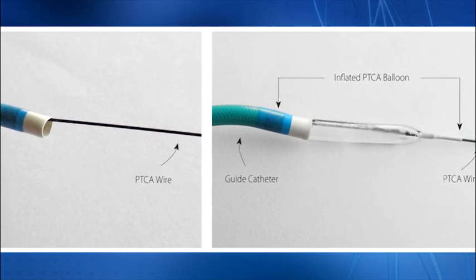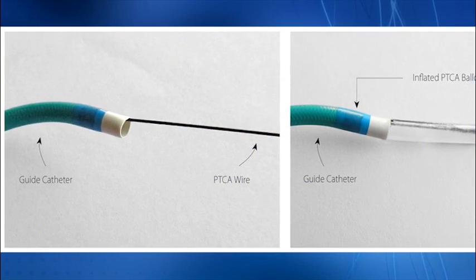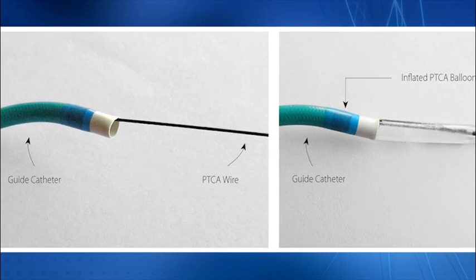We describe it as balloon assisted tracking of a catheter. You need to define the anatomy, cross the segment with a 0.014 inch floppy tip PTCA guide wire. If you are using a 5F diagnostic catheter, use a 1.5 millimeter PTCA catheter, and if you are using a 6F guide catheter, use a 2 millimeter PTCA catheter. With 7F guide, you can use a 2.5 millimeter PTCA catheter. Distal 4 to 5 millimeter segment of balloon should protrude outside the mouth of a catheter.